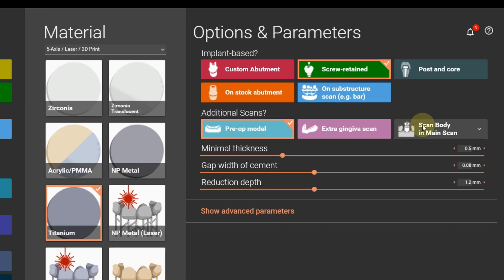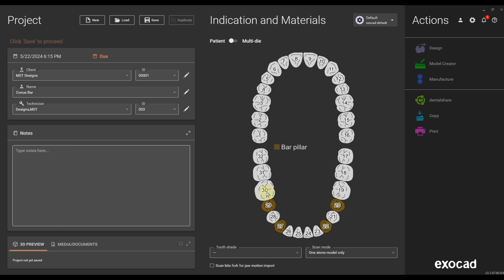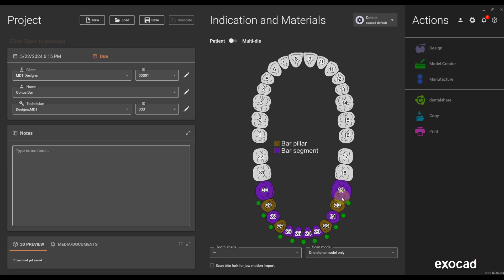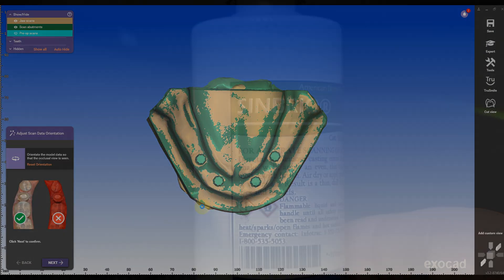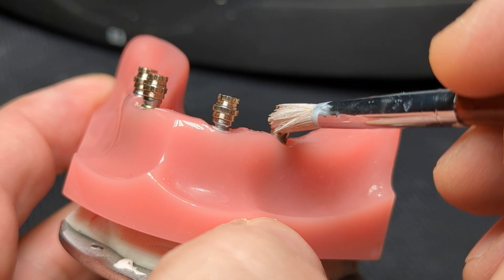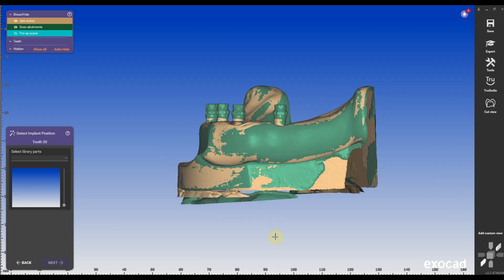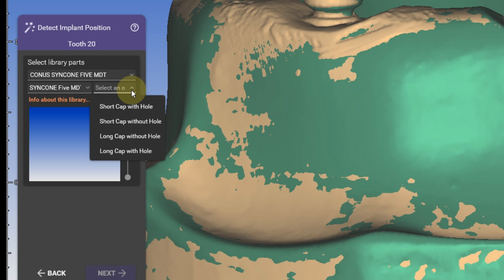After exporting the initial denture design with a base, we can proceed to the bar design using a new order form. We will use the initial denture setup as a pre-op, and it's always advisable to use an approved design or a denture try-in before moving into the bar design. I've created a special library for this workflow utilizing dense black Conus caps as scan flags. Since this is an experimental workflow, I'm offering the library for free for download to supporting members on my Patreon page.